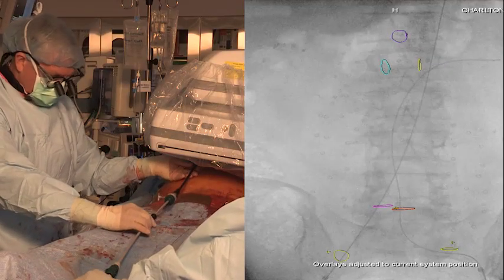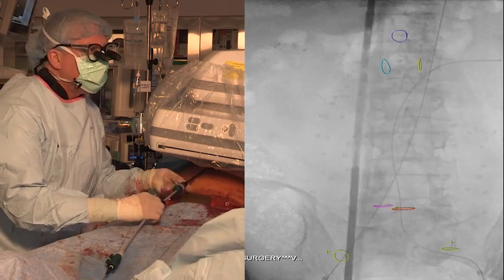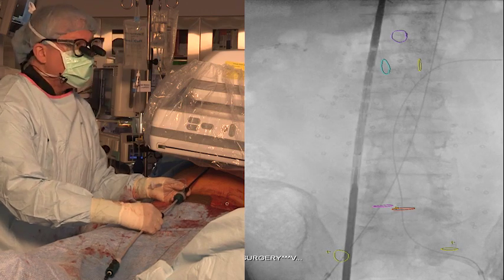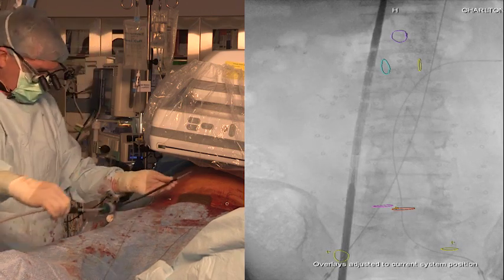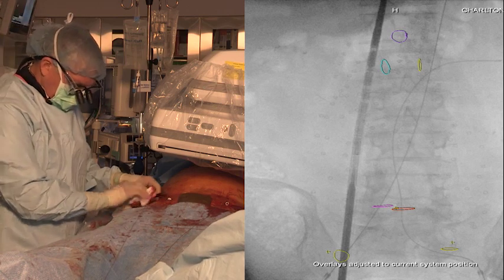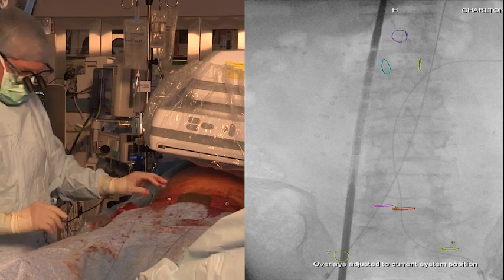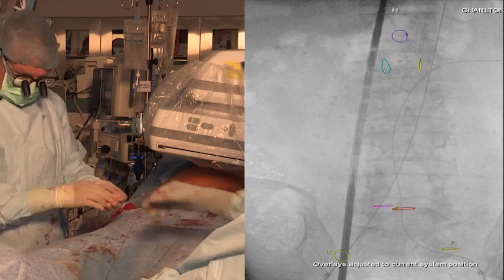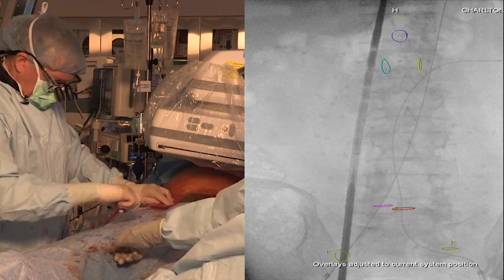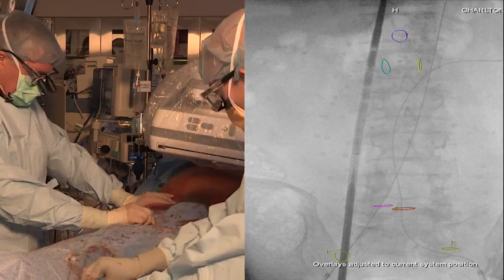Some practitioners choose to utilize the IVUS catheter from the contralateral side to watch the deployment of the graft. This enables them to watch the graft unfold from inside the sheath and confirm the graft material is below the lowest renal artery while cutting down on contrast and fluoro usage. This can be especially helpful in a case where the patient has a high creatinine or is suffering from renal impairment, and minimization of contrast administration is of the utmost importance.